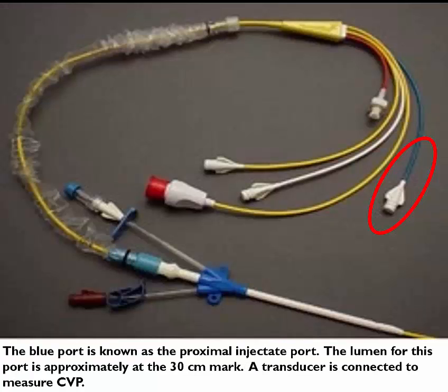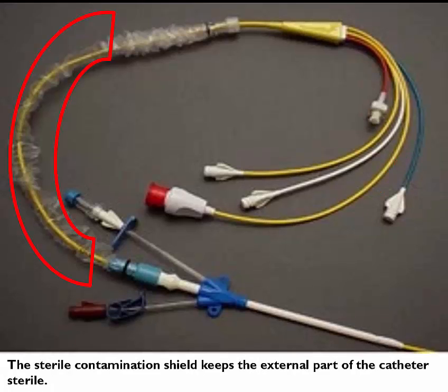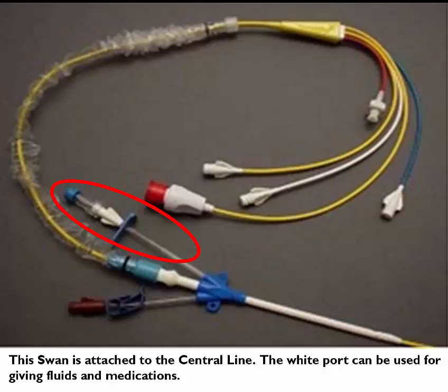The blue port is known as the proximal injectate port. The lumen for this port is approximately at the 30 centimeter mark. A transducer is connected to measure the central venous pressure. The sterile contamination shield keeps the external part of the catheter sterile. This one is attached to the central line.